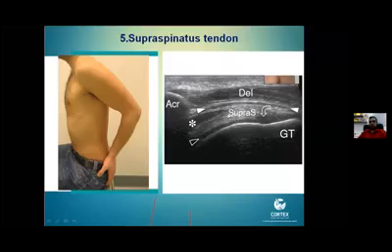And here in the supraspinatus, you can see this black area. You should not think that this is some abnormality or some part of the bursa. While injecting, that is a common mistake. This is actually the myotendinous junction of the supraspinatus, the muscular part of the supraspinatus tendon. And here, this hypoechoic area is the cartilage, the glenohumeral joint cartilage of the humeral head.